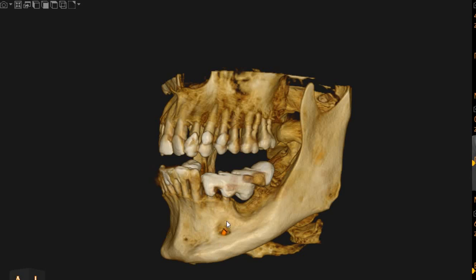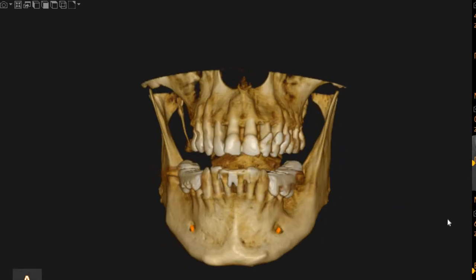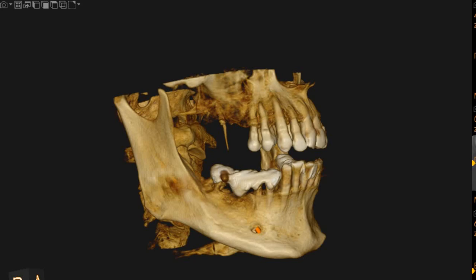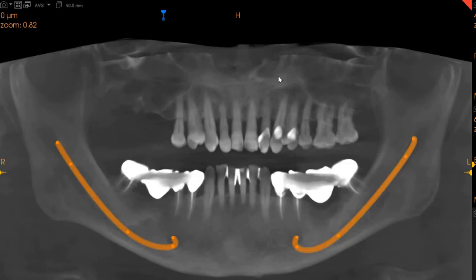Hello and Assalamu Alaikum. Ultra Scan Diagnostics here. This is the CBCT of the patient that you had requested. The area of interest has not been highlighted, but just to give you an idea.